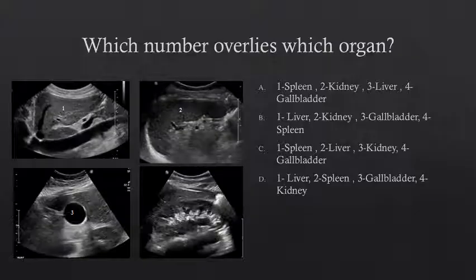In the first image, the number one overlies the liver. In the second image, the number two overlies the spleen. In the third image, the number overlies a hypoechoic structure with posterior acoustic enhancement, which is the gallbladder. In the fourth image, the number overlies the central echogenic fat of the kidney — notice the surrounding hypoechoic cortex.